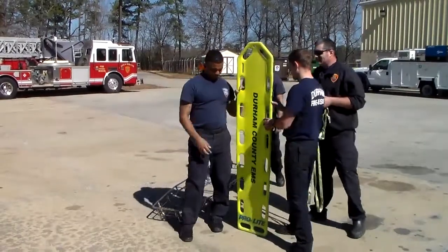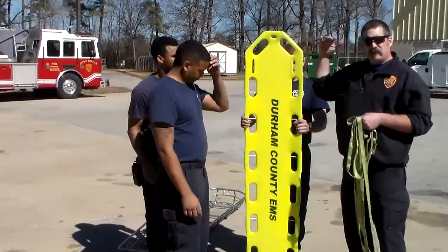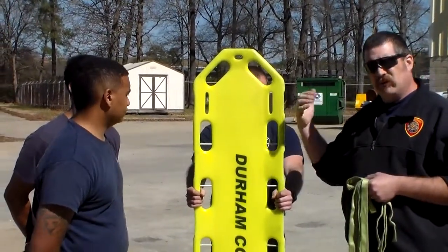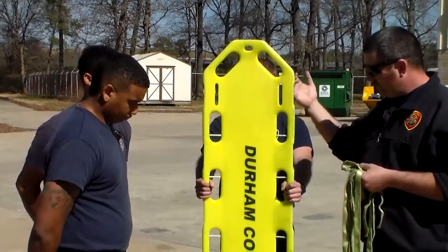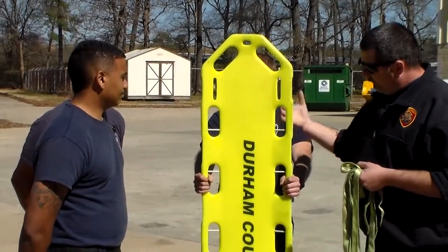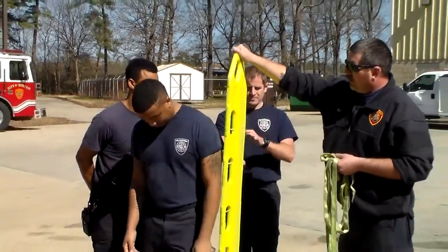With our backboard, we'll talk about setting it up and getting it rigged. We're going to show you first with the patient standing and then we'll lay you down. With it up first, you'll be able to see how the webbing goes on the backboard and flows from port to port. Jonathan is going to be our patient.